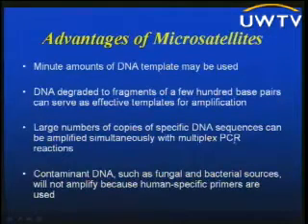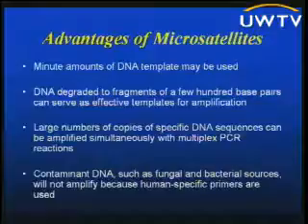It's a multiplex reaction, as I said, so you get large numbers of copies of multiple DNA sequences that are amplified simultaneously. And finally, you don't have to worry about contaminant DNA, such as fungal and bacterial sources, because they don't amplify. The PCR primers are actually human specific, so you never have to worry about maintaining sterility and worrying about the source. Of course, it's not all advantages.